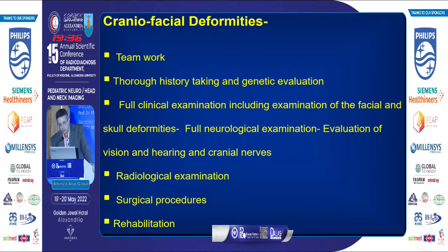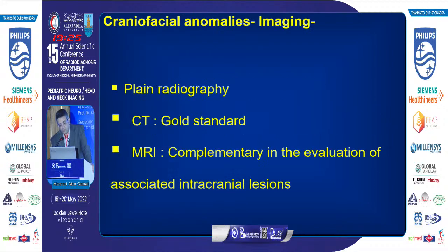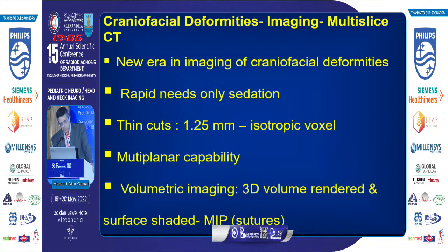It needs teamwork and management, including thorough history taking, genetic evaluation, full clinical examination, radiological examination, surgical procedures, and rehabilitation. So what we are concerned about is the imaging diagnosis. It includes plain radiography, computed tomography, multi-detector, which is the gold standard, and MRI, which is complementary in the evaluation of associated intracranial lesions. So with the appearance of multi-slice CT, a new era has come in imaging of craniofacial deformities.